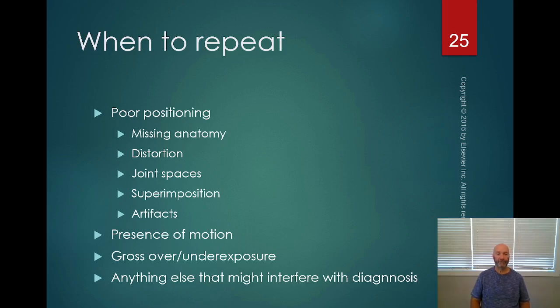But if the patient, for example, has telemetry, a heart monitor on, they usually put a heart monitor in a harness that just hangs around their neck. So you're taking a chest x-ray on a patient, you've got this thing sitting in the middle of their chest that could potentially interfere with a diagnosis. So you don't necessarily need to take the heart monitor off of the patient because it's got the leads that are plugging into the patient in different places.